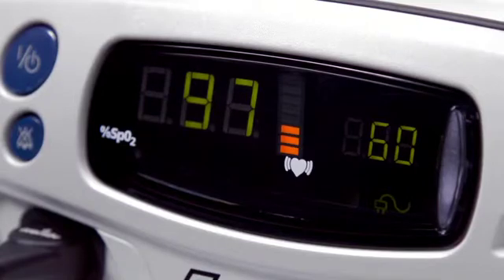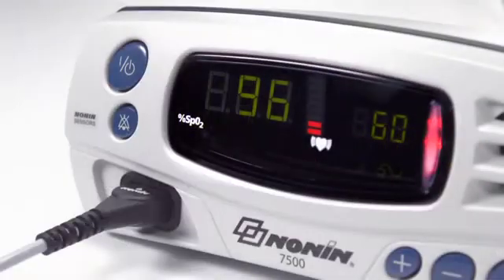Green bars indicate a strong pulse signal. Amber indicates a marginal pulse signal. Red indicates a low pulse signal. It is a good idea to check pulse signal quality at start-up and adjust the sensor for a stronger reading if necessary.